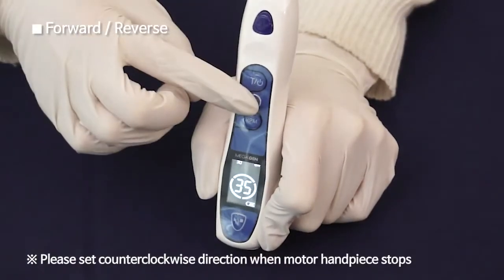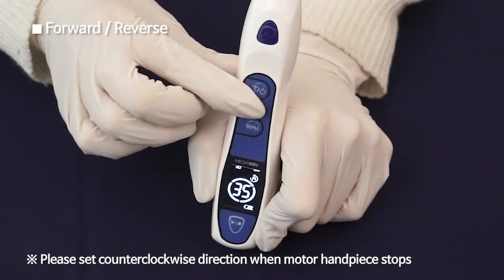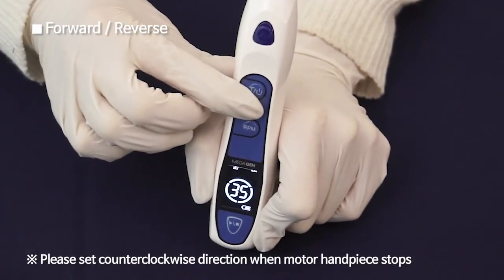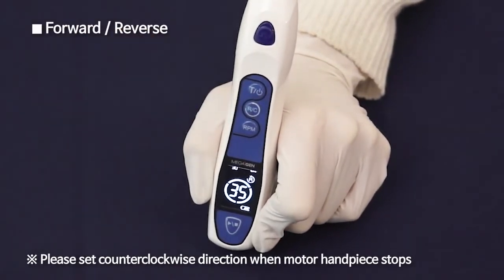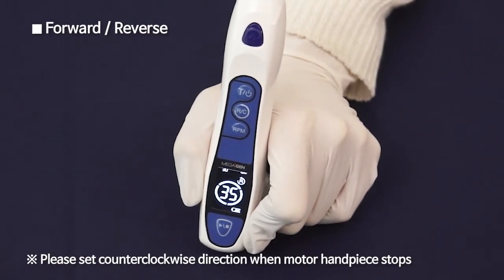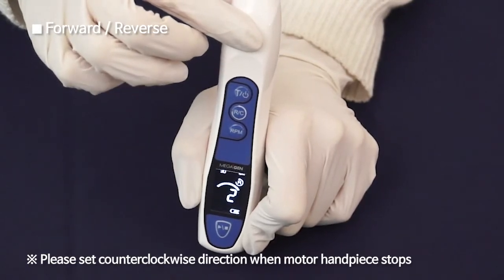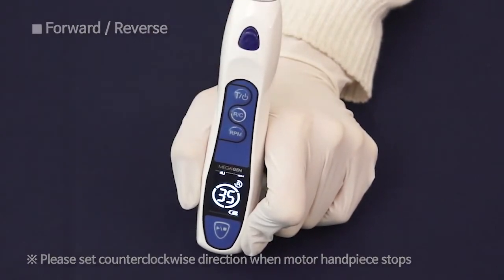Forward and Reverse Button: Pressing it less than 2 seconds can change the direction of rotation. When counterclockwise is set, the LCD panel shows R and a faster beep comes out than when set clockwise. If you press the button again, clockwise is set and R on the LCD panel disappears.